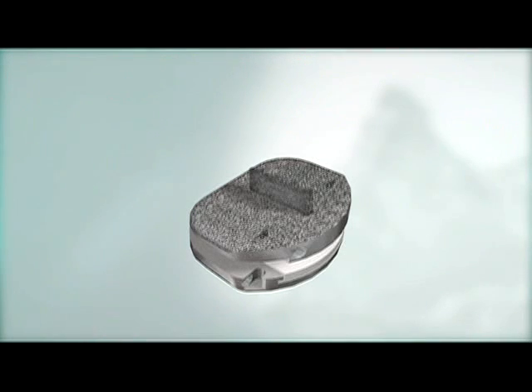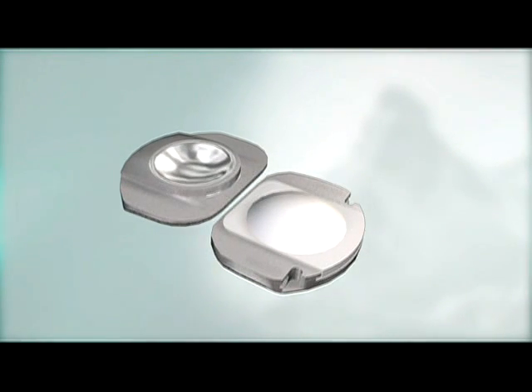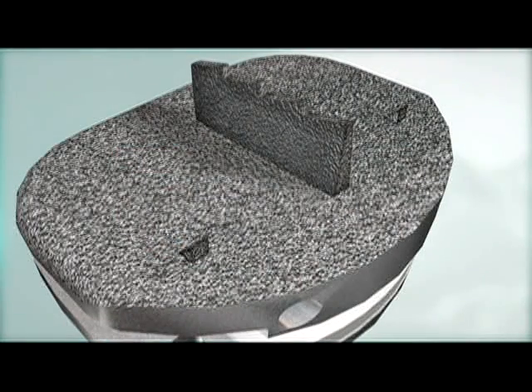The ProDisc-L Implant is based on a ball and socket design. ProDisc-L End Plates have patented central keels and lateral spikes for initial fixation to the vertebral bodies and a plasma-sprayed titanium coating on all bone-contacting surfaces to promote bony integration.